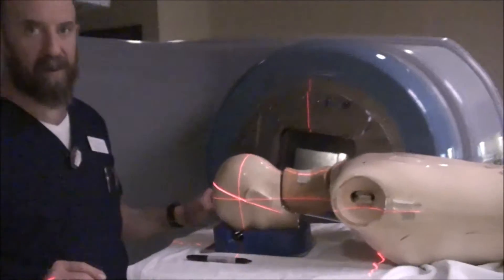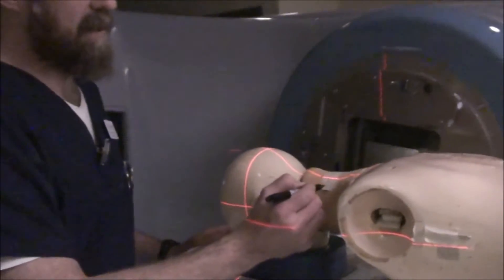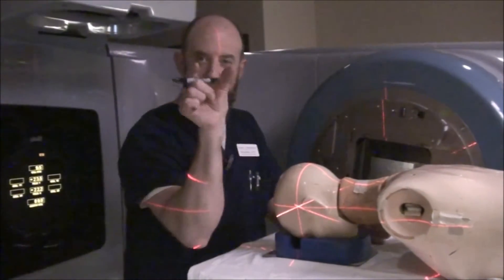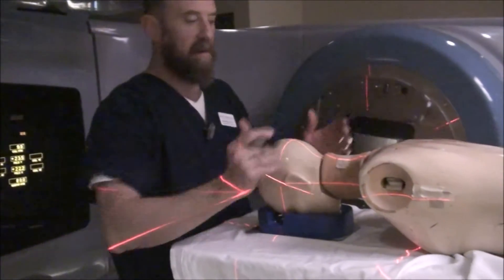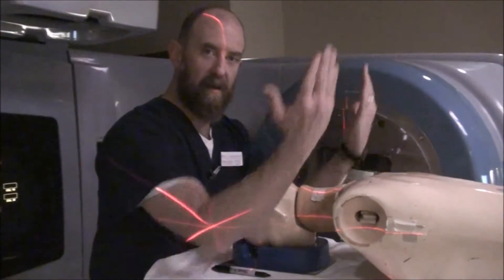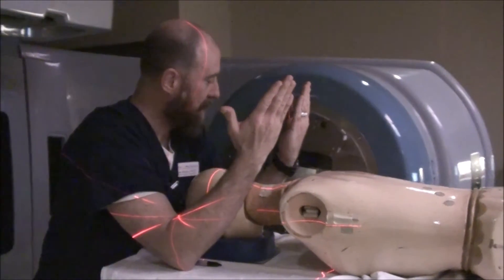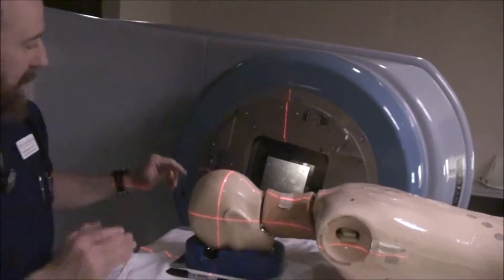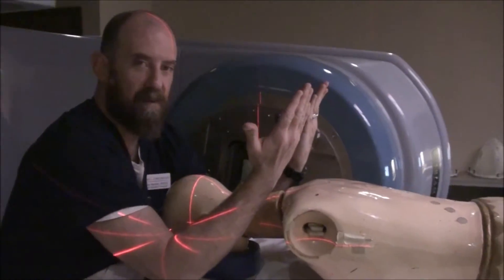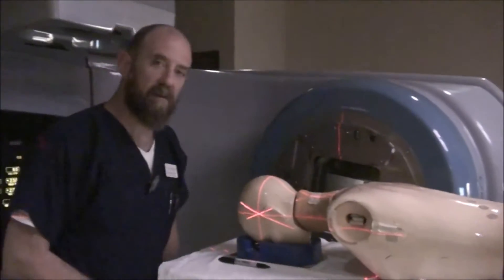Then you're going to mirror your table, mirror your collimator, mirror your gantry to the other side. Also mark with dots that particular line, and mark as far down as you can on the neck. You want to be able to see as much of that divergence as possible because you're dealing with a relatively narrow field on the posterior. What we're determining is the collimator angle that sets our match line to the posterior superior field edge. The collimator is kicked back, and this line demonstrates the divergence from the posterior edge. Treat, rotate over, mirror everything, treat again.